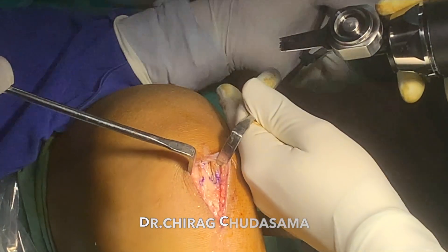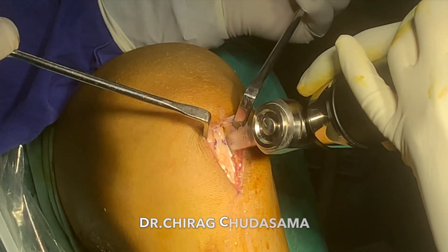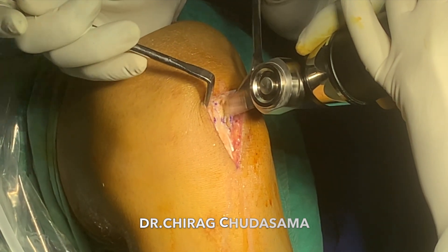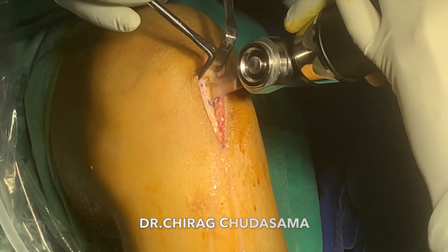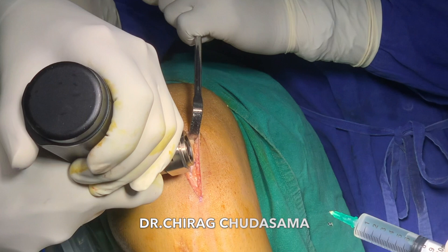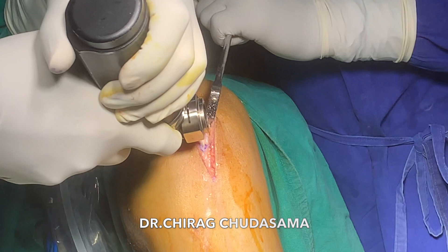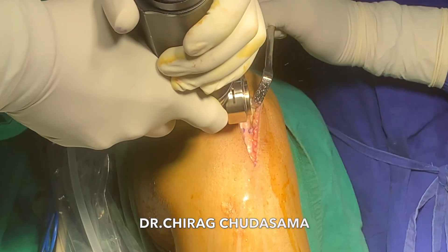Now using this small saw which has markings on it, we start harvesting the bone plug on the patellar side first, putting the lateral side first because we are operating from the lateral side of the patient. This is the lateral side harvest using the small saw. You need to penetrate the patellar bone up to only 1 cm, not more than that, because if you penetrate more there are higher chances of patellar fracture afterwards or intraoperatively. After completing the lateral side, we come to the medial side and again use the same technique with the small saw, to a bone depth of up to 1 cm.